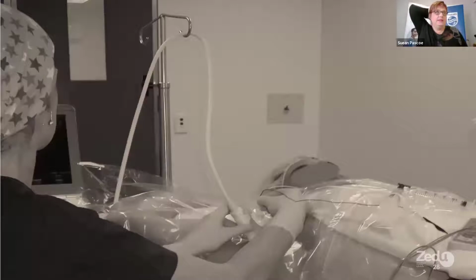Another tip is to use a drip stand to support the weight of the probe. Once you have your field all sterile, you don't want your probe falling off on the ground and all the rest of it. Also, the weight of the cord can sort of drag you ever so subtly off your target. So if you just suspend the cord over the drip stand, it takes the weight of the cord, but also means that when you need to put things down to pick it all up, everything's there ready to go quite easily again.